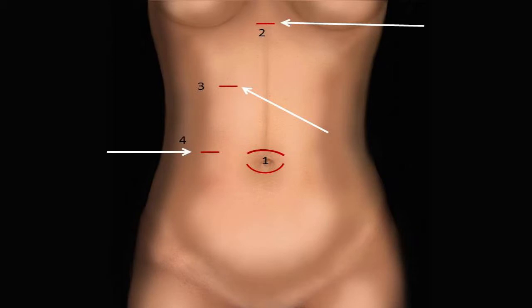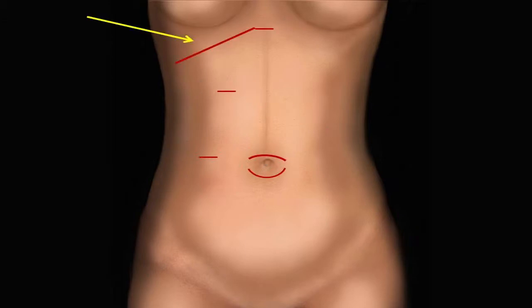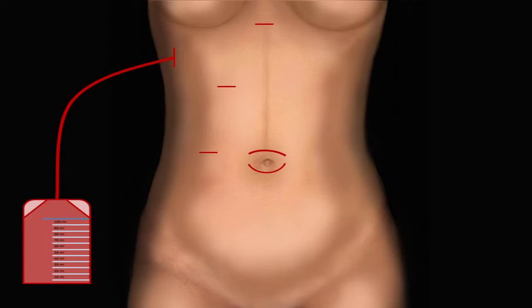Sometimes it is not safe to proceed with keyhole surgery, and a larger incision on the right-hand side of the abdomen is made. Sometimes, because of severe inflammation, it is not safe to proceed with the operation and it may have to be abandoned. At this point, the gallbladder may be deflated intraoperatively, or you may need to have a tube called a drain inserted into the abdomen. The aim of this is to relieve the inflammation, and the operation will be rescheduled for 6 to 8 weeks later.